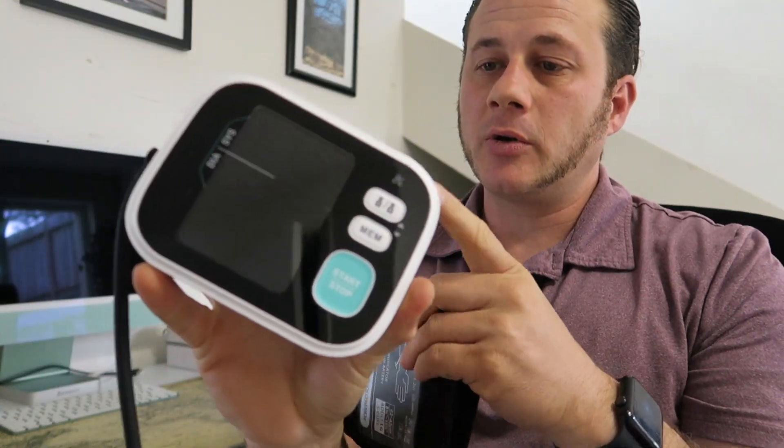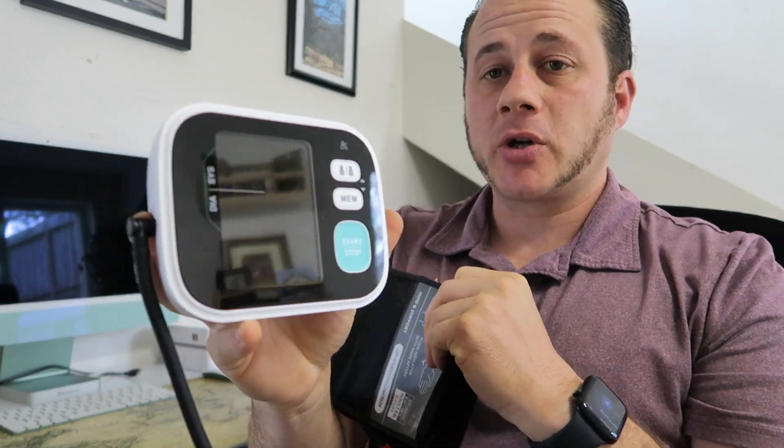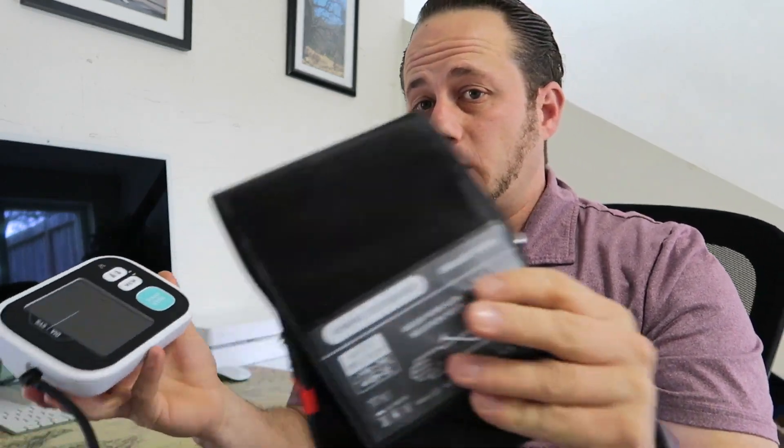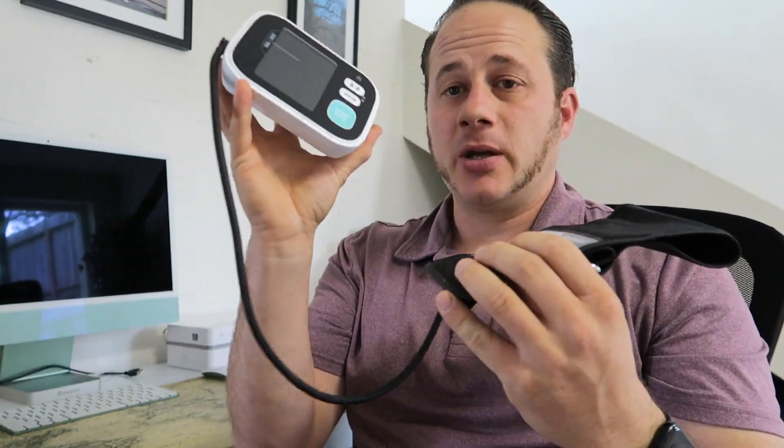Today I'm going to be going over this Greater Goods Blood Pressure Monitor Cuff. Something I need to monitor — it's very important to monitor, especially if you have stuff like hypertension. You want to make sure it's not getting out of control. I was told to get one and my old one wasn't working, so I picked this one up.